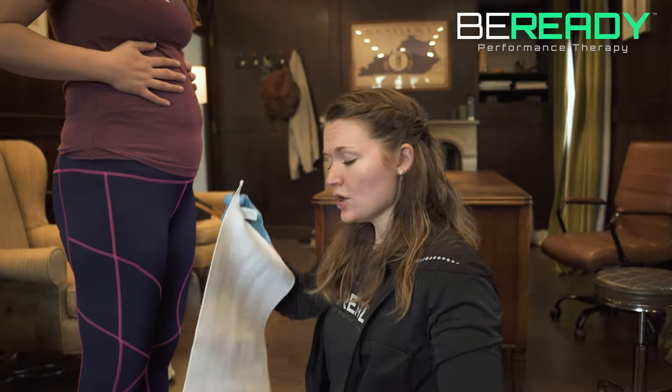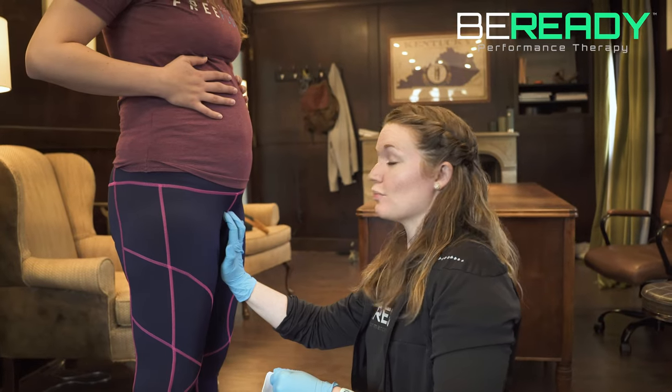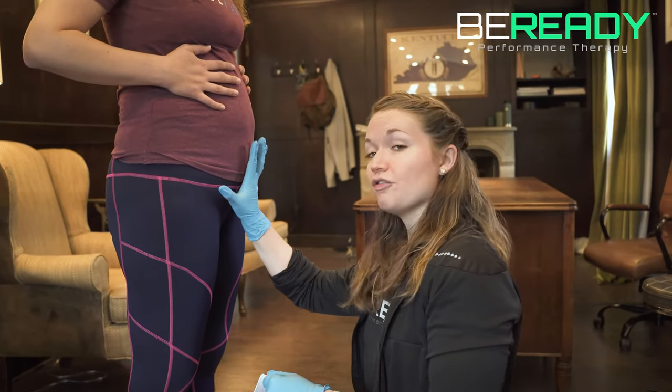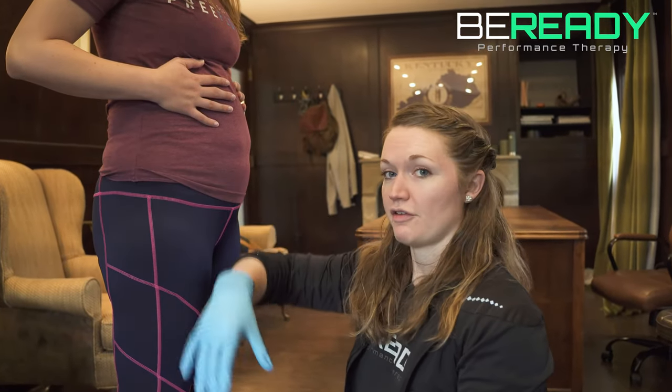When you put this on, we want it to sit lower. Right at your pubic bone is where the bottom of that binder should be, and it should lift up and off of your incision to help with pressure. It'll also take some pressure off of your low back.